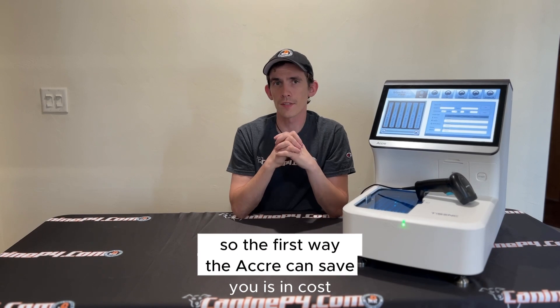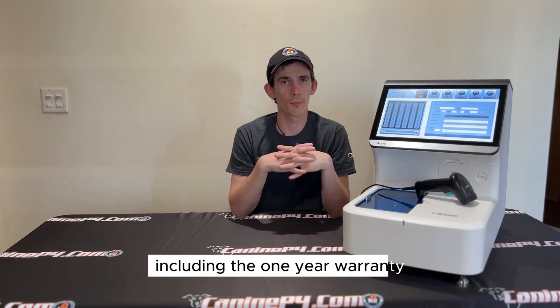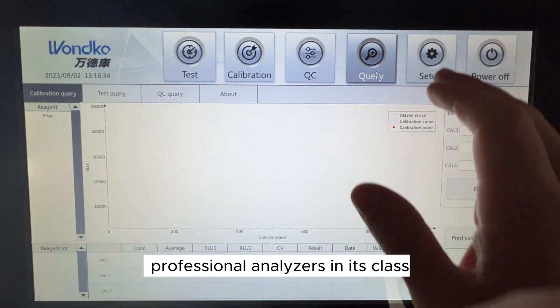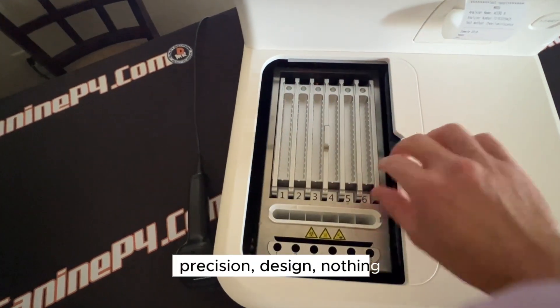The first way the Accre 8 can save you is in cost. With an MSRP of $20,000 brand new, including the one-year warranty, it's more affordable than other similar professional analyzers in this class, without compromising accuracy, precision, or design — nothing.